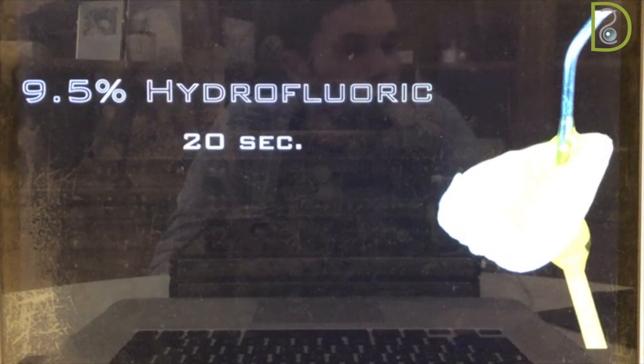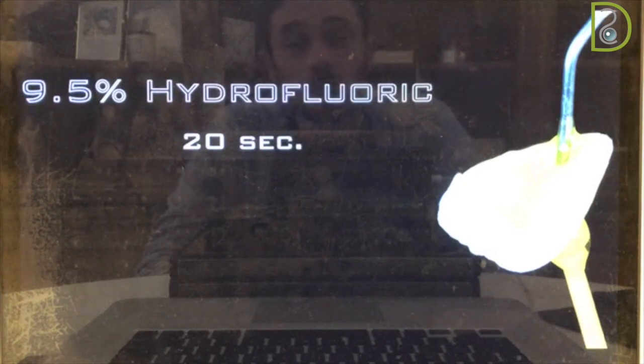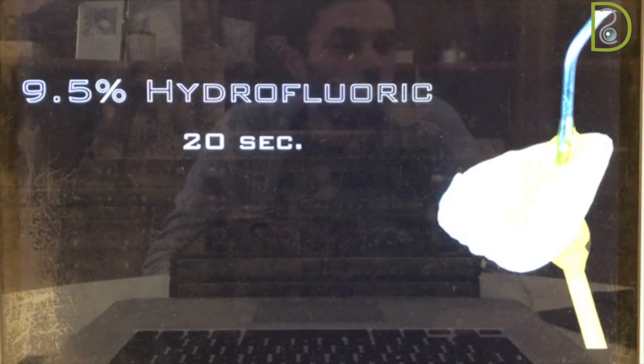So again, this etching time is specific for this concentration and this company. So as we said, you need to go back and check the manufacturer instructions. Now, once you apply this material, the fitting surface should look dull, it has to be frosty, but it cannot be polished, it cannot be glossy, it has to be like this frost, like a chalky look. You don't want to get it too chalky, this is not going to be good for your veneer, but it cannot be that glossy.